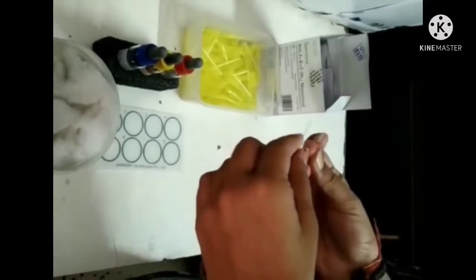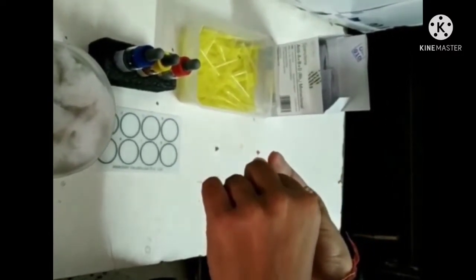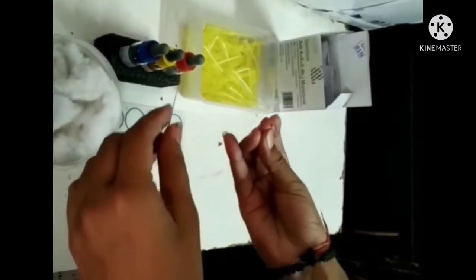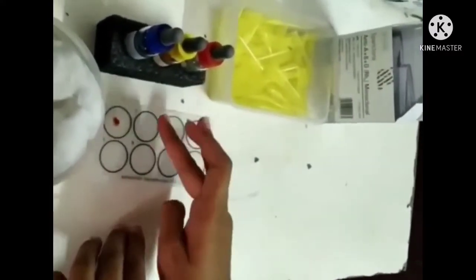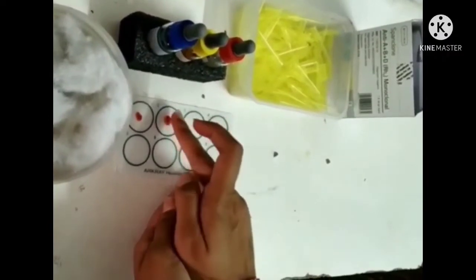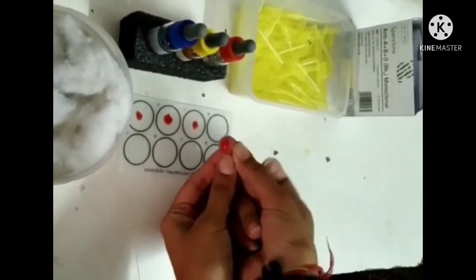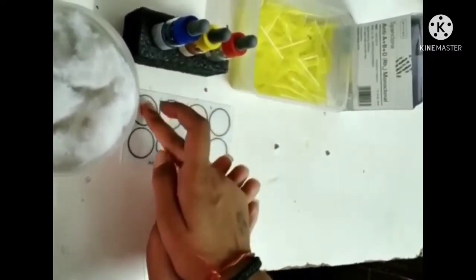Prick the fingertip with the syringe and wipe off the first drop of the blood. As blood starts oozing out, allow it to fall on the 3 circles of the glass slide by gently pressing the fingertip. Apply pressure on the site where it was pricked, and to stop blood flow, use the cotton ball if required.